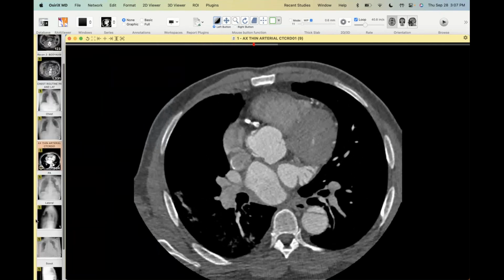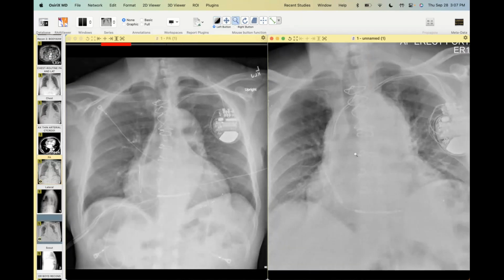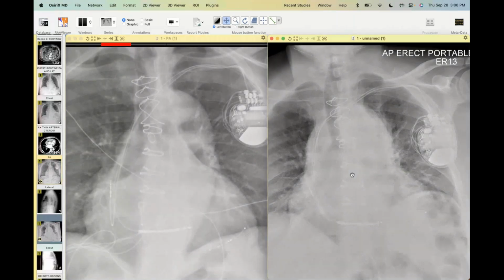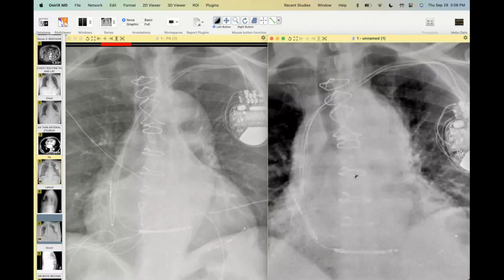And then fast forward to this year, and I'll show two radiographs because I think this is where it gets really interesting. They had a pacemaker or AICD placed this year, a few months ago. And then this is the more recent radiograph, a different technique, but the mediastinum just looks a little fuller, particularly on the right. It might have been a little rotated, but the subtle finding, and this was all at the outside hospital, so I'm showing this in hindsight, knowing what was going on, is really interesting. You can see the right paratracheal space looks a little thick. The trachea even looks like it's bowed a little to the right here.